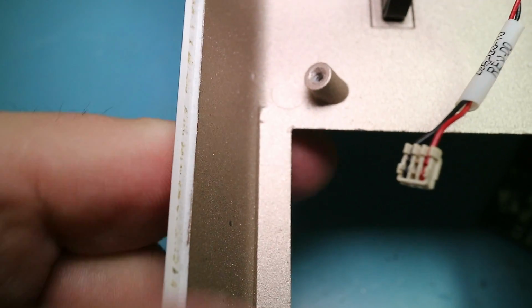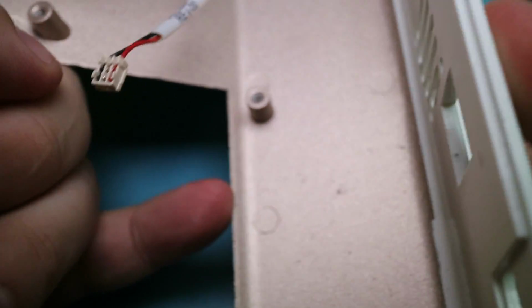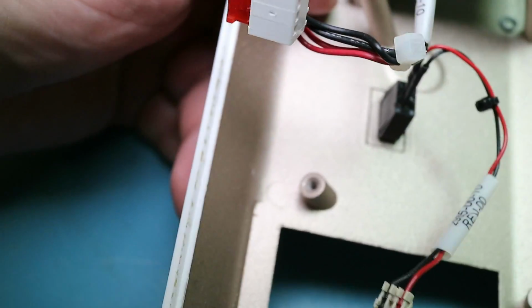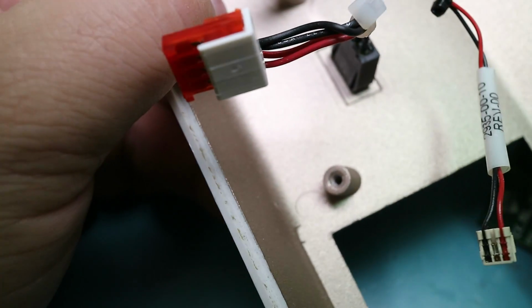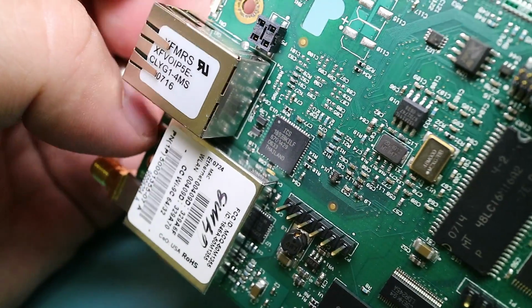Oh, and the case itself is this metallized plastic, and it's very tough for the most part. The back here, where it's got a lot of cutouts, is a little weak. It also doesn't have the metallized part at the back. But yeah, it's a very sturdy case, and I don't know if it made any difference for the non-demo units, but you know, I paid next to nothing for this thing, so I figured it was worth just getting to check it out.